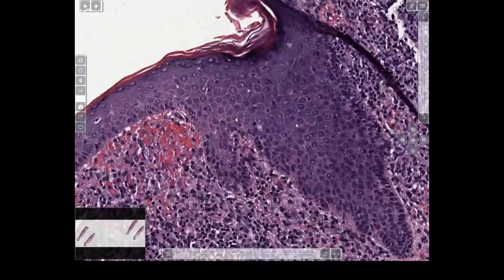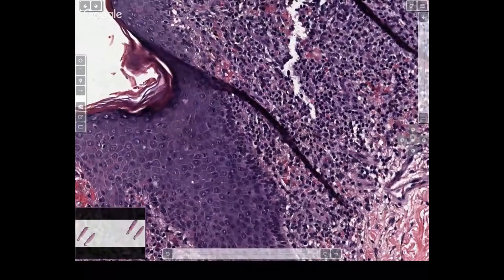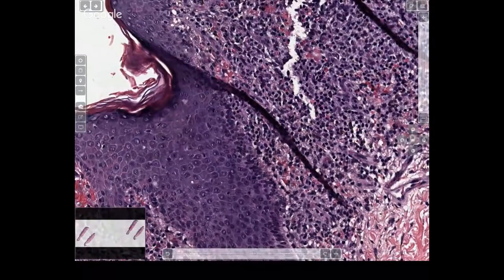So again, a lichenoid infiltrate at the dermal epidermal junction composed of lymphocytes and histiocytes, but with a lot of red cell extravasation. Then the diagnosis is lichen aureus. Remember, there is always clinico-pathological correlation. So you're always going to go back and look at what the clinician was thinking. If it was a single lesion, the clinician is thinking of some sort of purpuric lesion, and you see this lichenoid infiltrate, then your diagnosis is going to be lichenoid purpura, or the other name is lichen aureus.